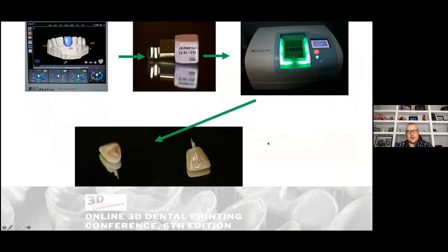This is the pretty common workflow. Okay, this is the digital workflow involving milling in dentistry. Our number one thing we have to do is get some patient information, and this would be scanning inside the mouth. Okay, so we've scanned the tooth, and what you see there is we've done a digital design of the tooth, because it has to fit with the rest of the teeth, it has to fit with the bite, and this takes a substantial amount of time and some skill.